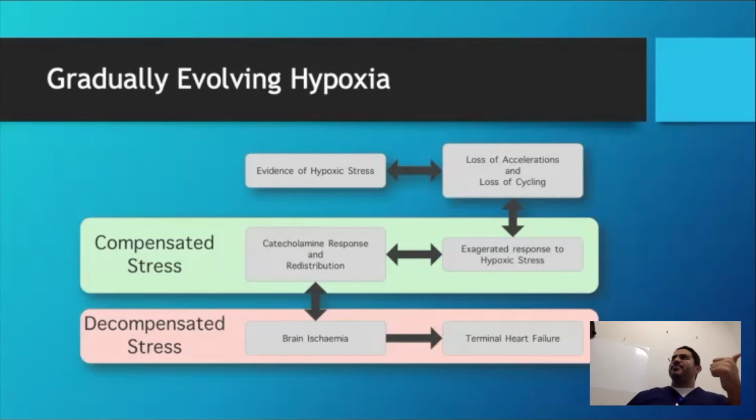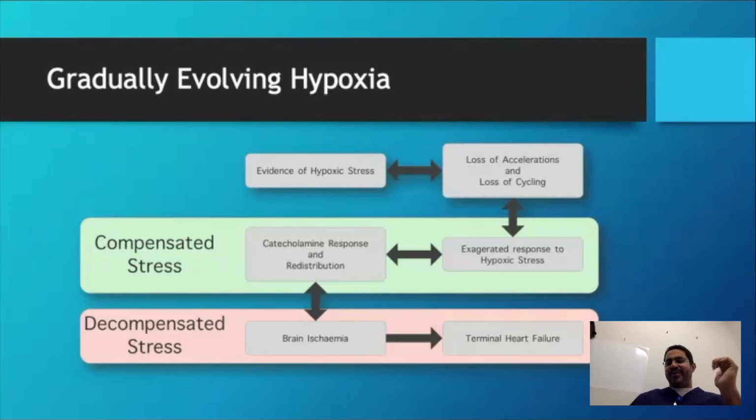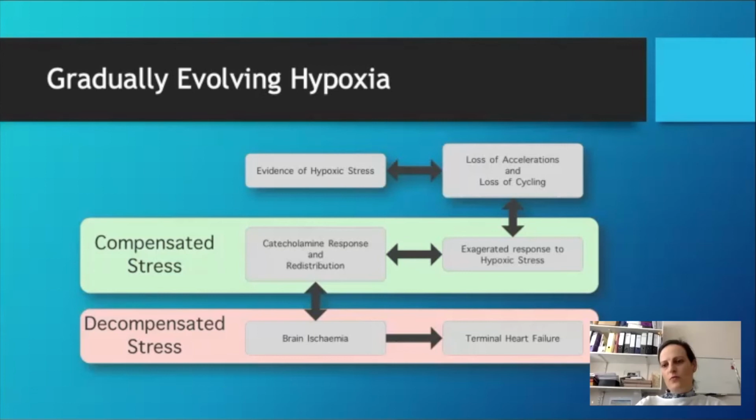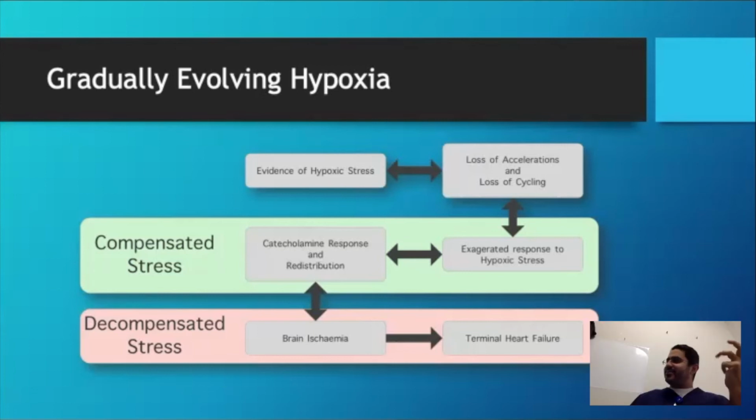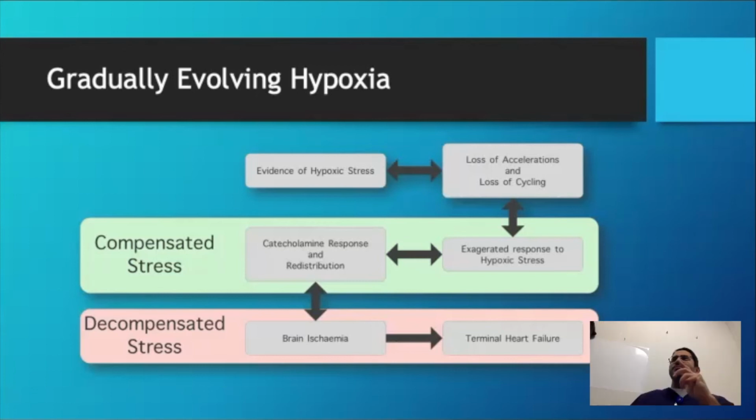Stable baseline, appropriate for gestational age. Any guesses? Come on, you use it every day. So the responses we're hearing are stable baseline, appropriate for gestational age, normal variability, cycling, accelerations. Do you need accelerations? You don't need accelerations.